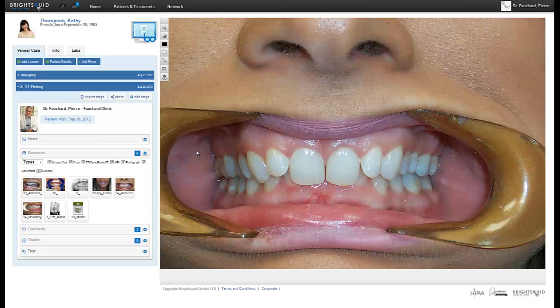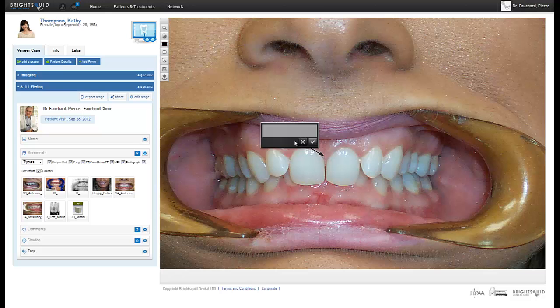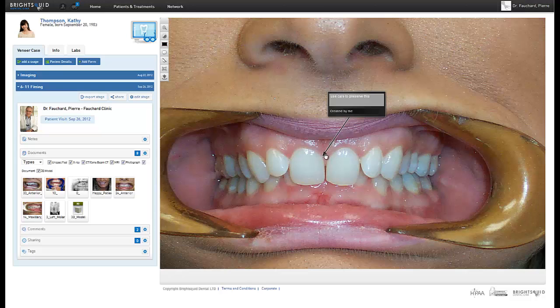This next button allows you to annotate or mark up the active image. Single-click on this WordBubble button, then click and drag on the image to draw an arrow to the section of the image you wish to annotate. Once the arrow point is in the right location, release the mouse button and the annotation box will appear. Now you can type your note into the annotation box and click the check mark to finalize your arrow and notation. If you choose, you can now fine-tune the location of the arrow point and the annotation box — just click and drag. Note that any notes you type into these boxes will be visible to any colleagues you have shared this case with.